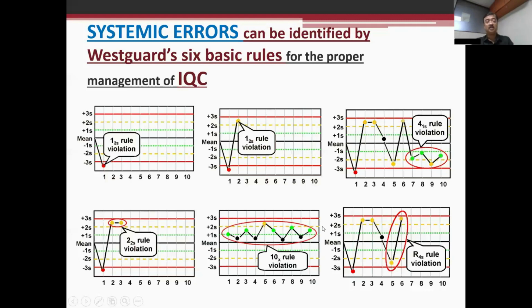So now you can tell me why there is so little patience in 1-3S, and then patience increases. That means the more the deviation, the less is our patience. The 3S violation is such a wide, bad violation. I cannot wait for the second day. I have to take a corrective action. But when it comes to a 2 standard deviation violation, I call it that the system is biased. The system is actually shifted to one side.